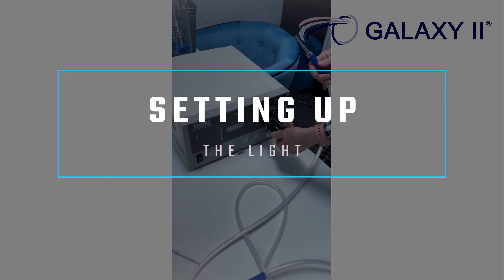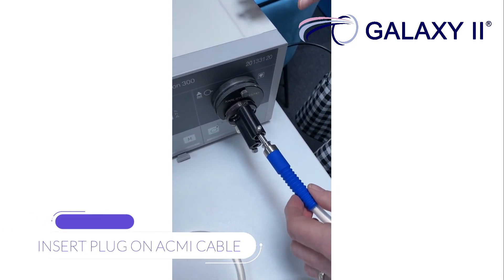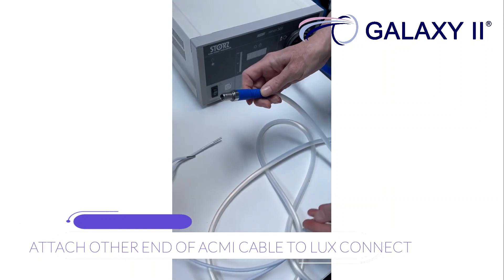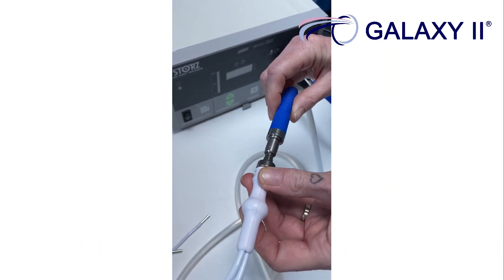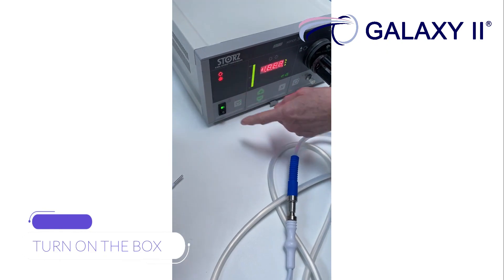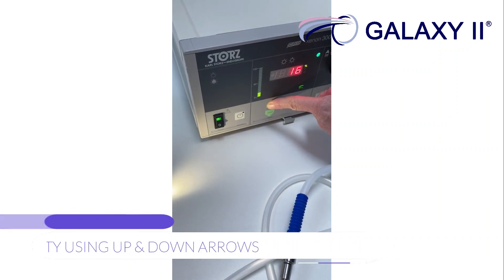Set to Storts. Insert the plug on the ACMI cable. Attach the other end of the ACMI cable to the connect. Turn on the box. Adjust the intensity using the up and down arrows.